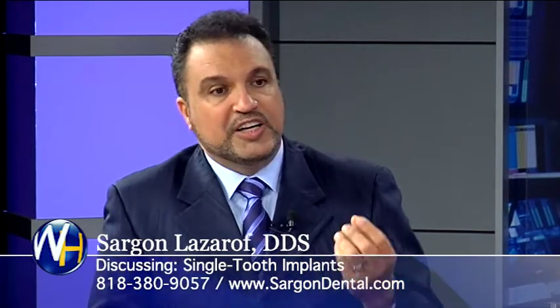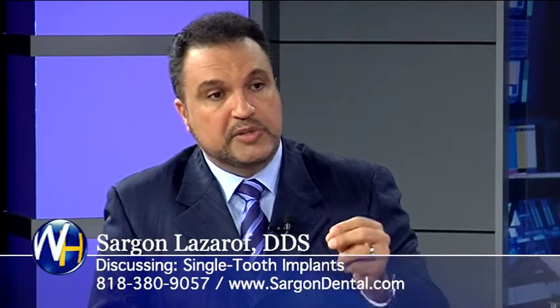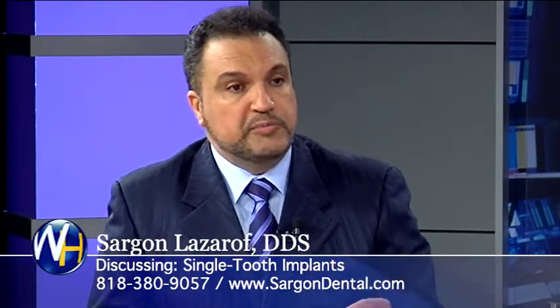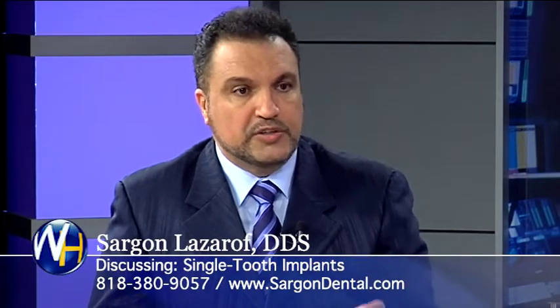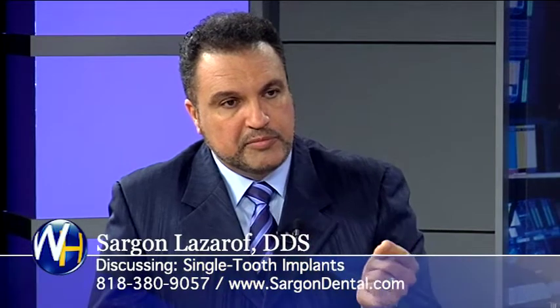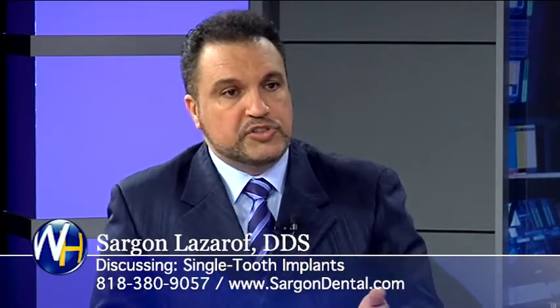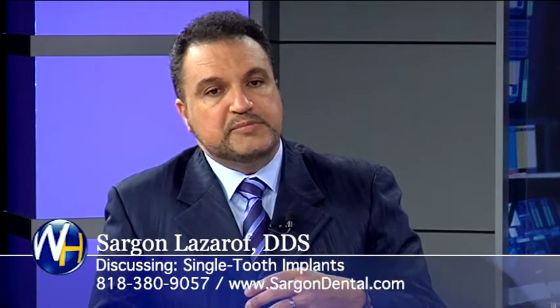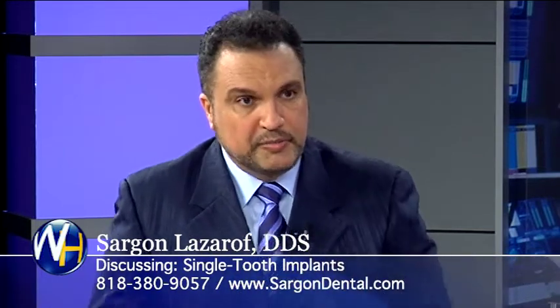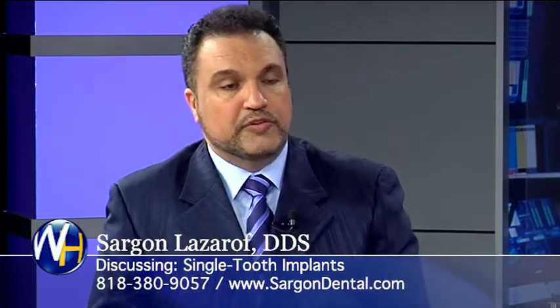So the patient gets the tooth right there, and we prevent the bone loss and gum loss that occurs with the traditional implants, where you take the tooth out and you don't place anything. That halo-shaped gum, the papilla that we call, all of that is gone. It takes months of surgery to bring that back. And this makes it much more cost-effective because we prevent that from being lost, and so you don't have to pay for it to be recreated.